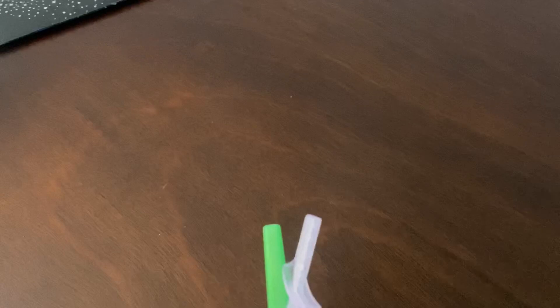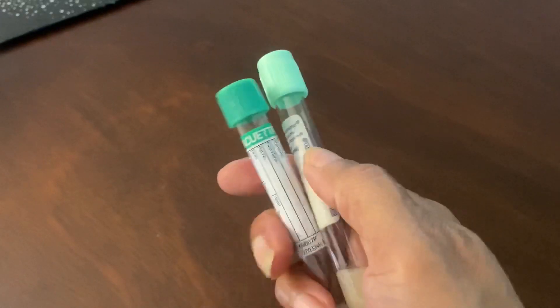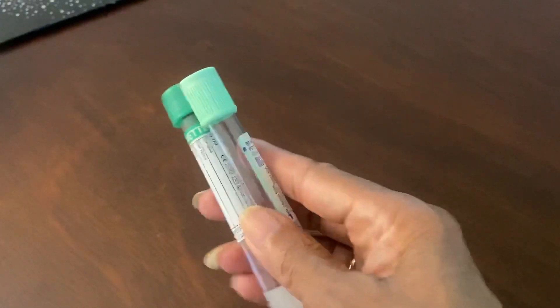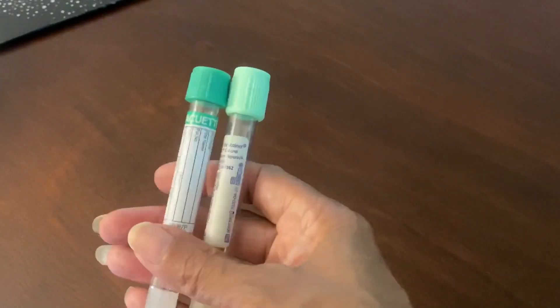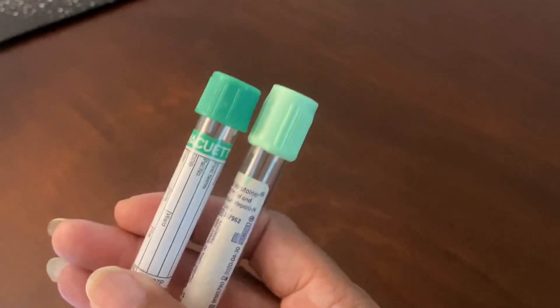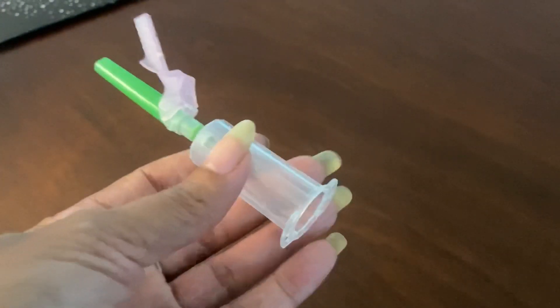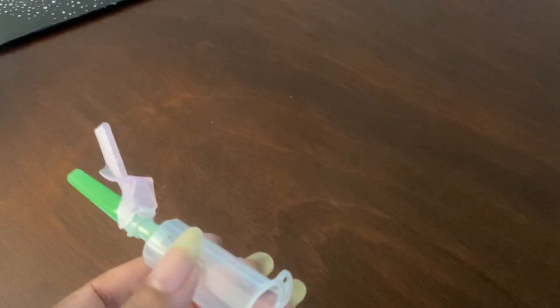I wanted to go over this because I had received a few questions about the system, and someone asked about these two tubes again. It's different manufacturers — that's the only thing. These tubes have lithium heparin inside them. Read your labels and there are no problems. Just know that if a tube has been punctured prematurely, you have to get a new one.